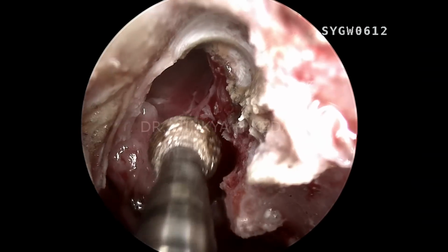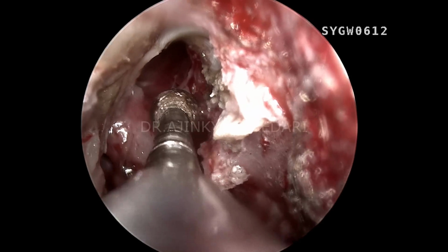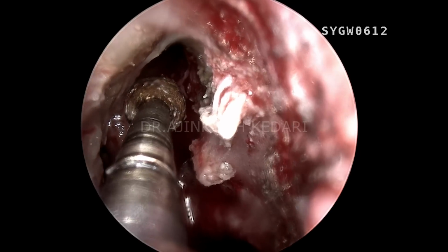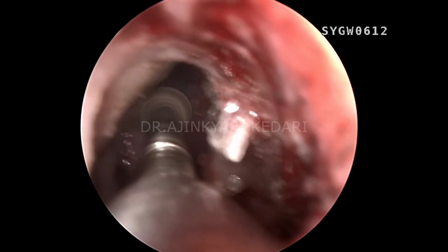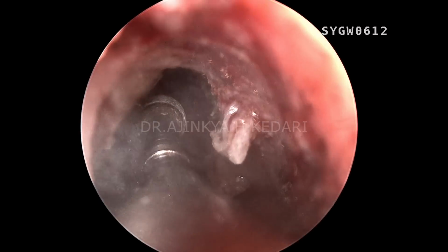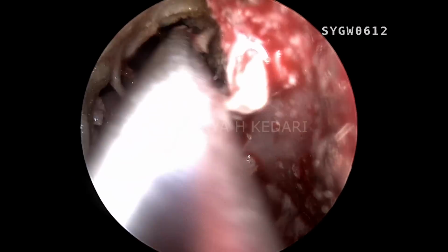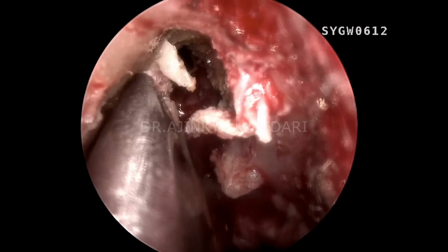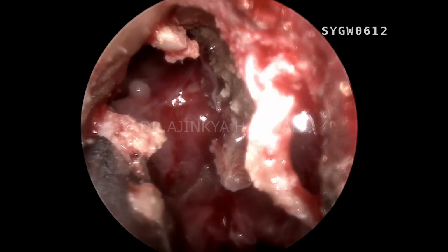And now with the help of a unilateral extended Draf, you can see we have managed to achieve huge visualization inside. So I'm going at 11 o'clock for the drilling. That is towards the orbit. So I might have to do an orbital transposition later on. So a little bit of drilling and now the bone punch. Now the bone I'm removing right now is a part of the frontal beak that is present more towards the orbital part, towards the roof of the orbit.